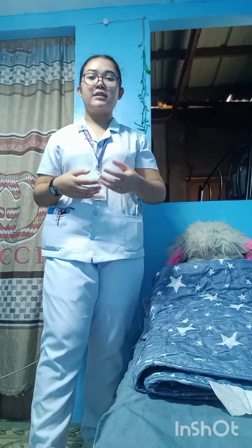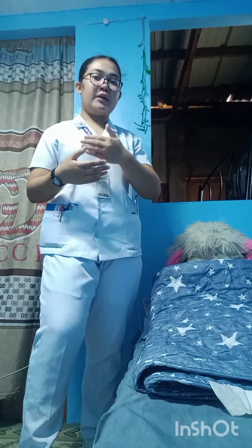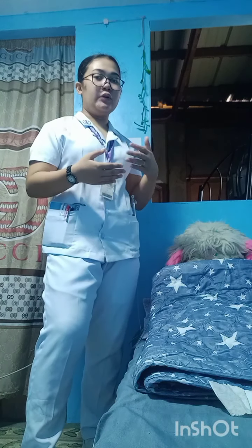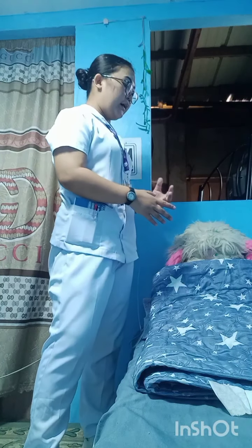Next is we're going to review the oxygen saturation and the ABG result or the arterial blood gas result if available. Kung available naman yung result ng oxygen saturation tsaka yung ABG ng patient, pwede natin siyang i-review. Kung ano yung mga baseline, pwede natin pagkuhanan ng mga base, yung oxygen saturation ng patient, yung mga ABG result ng patient sa pag-assess mo sa client or sa patient mo.